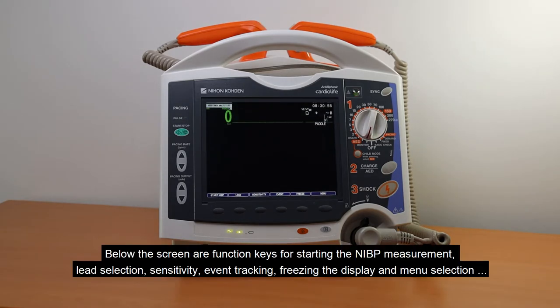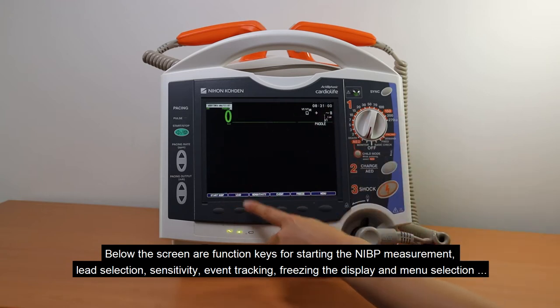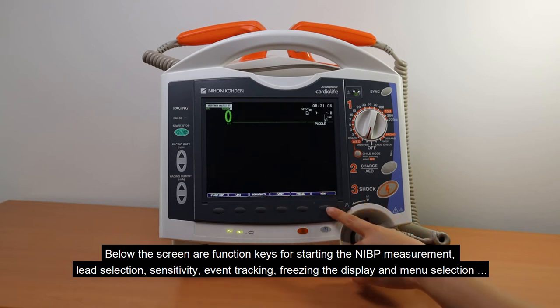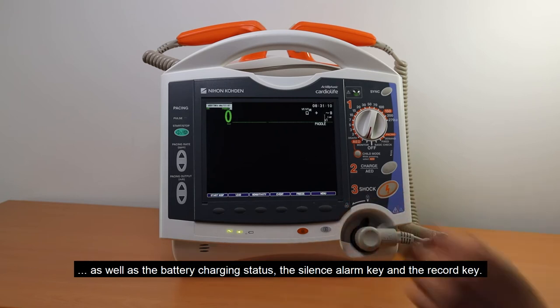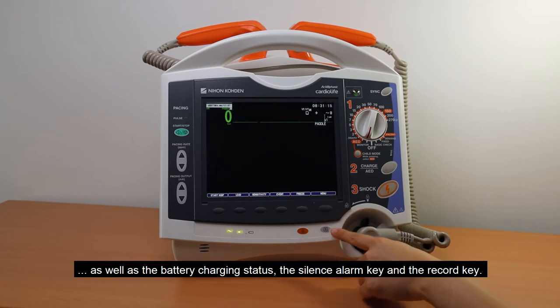Below the screen are the function keys for starting the NIBP measurement, lead selection, sensitivity, event tracking, freezing the display, and menu selection, as well as the battery charging status, the silence alarm key, and the record key.